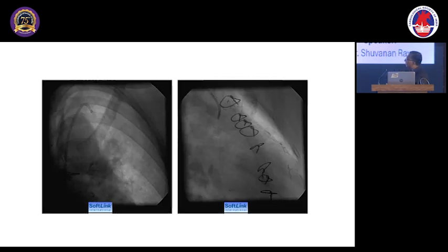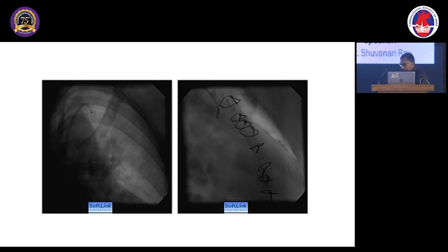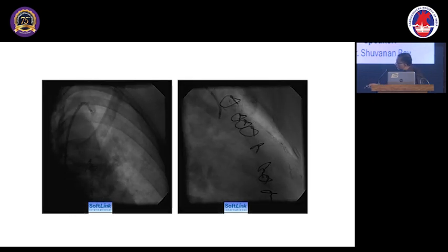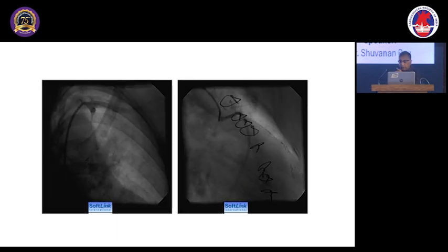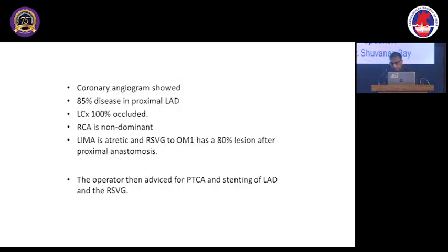And this is called ventricularization. This is a normal aortic pressure wave, and this is ventricularization. Ventricularization means there is a flattening between the two waves. If this is there, be very careful of ostial disease and do not take PCI unless you take care of this. And remember, sidehole catheters are a menace. Do not use a sidehole catheter. It will give you a false impression of security, which is not there. So a PCI operator should not use a sidehole catheter.